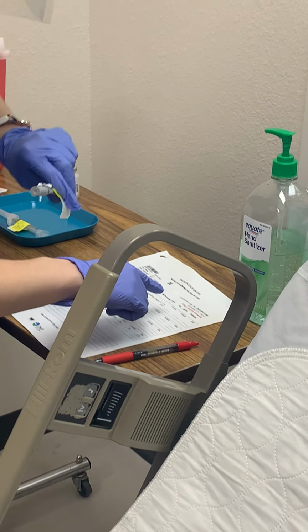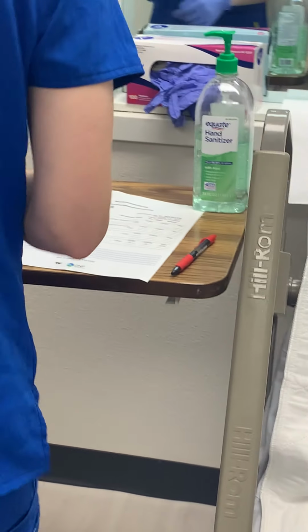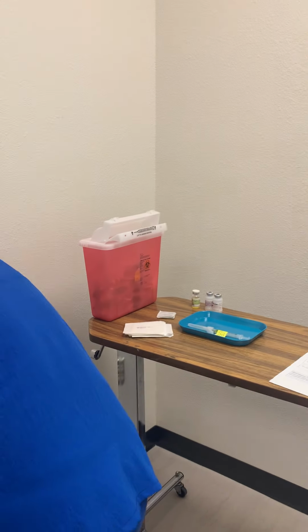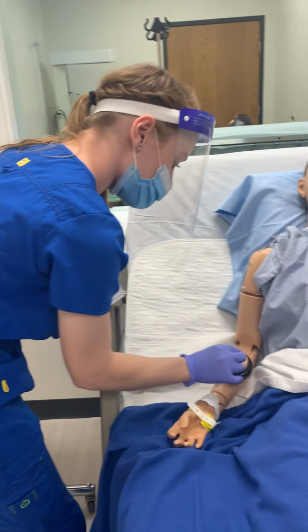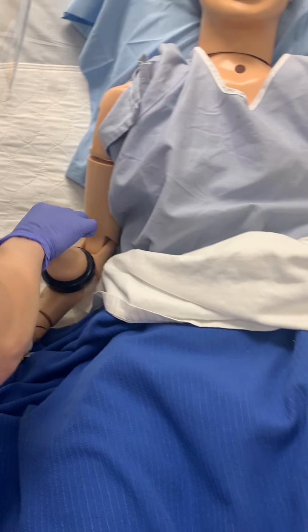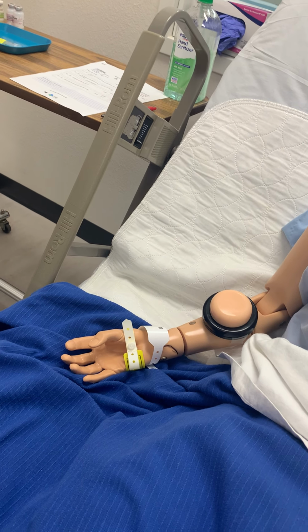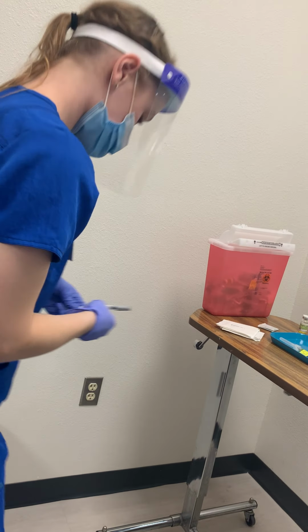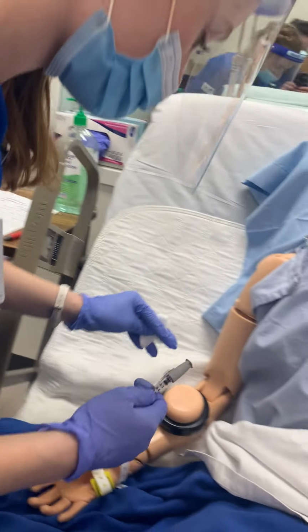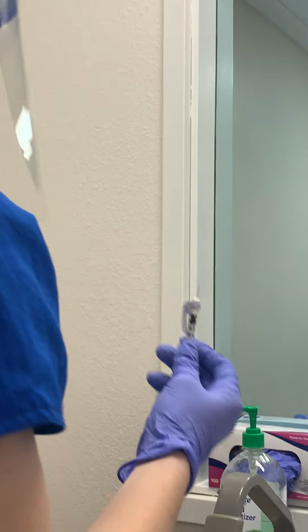At 10 a.m., so it's currently 10:01, so we're right on track. And then Shirley, so we're all good, Shirley. So let me just get your alcohol prep. I'm going from inner, outer. So Shirley, this is just going to be a little one. Let me get off the label so it's easier for me. And then I'm just going to have this in my hand. And so I'm just going to be going like this, Shirley. Okay, let me pull off the top.